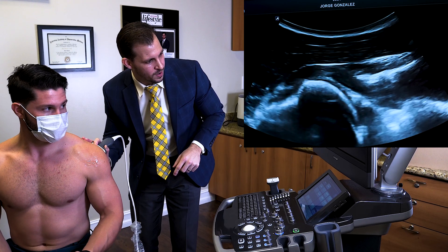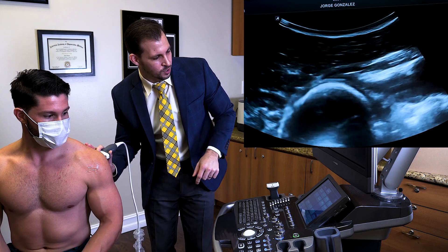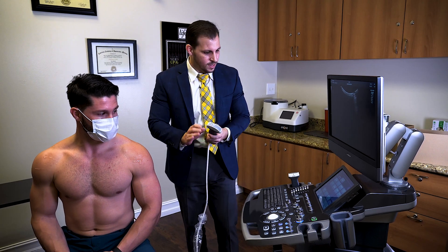Make sure you wigwag the probe to get a better image. If there's any fluid or effusion of the glenohumeral joint, we could also see that. Sometimes if there's been a prior dislocation, we could see a Hill-Sachs deformity as well. This approach is an easy, quick assessment of the posterior glenohumeral joint and visualizing the infraspinatus.